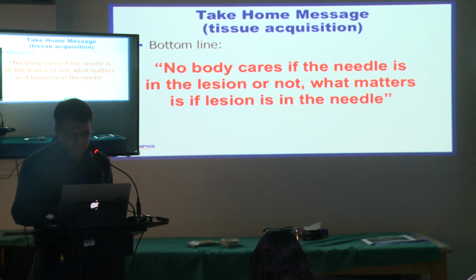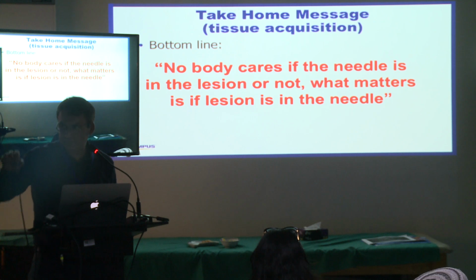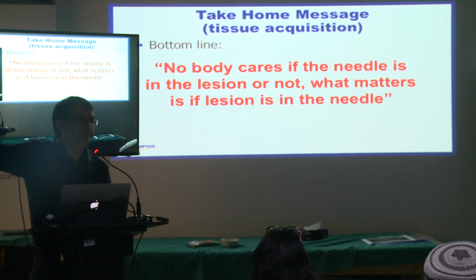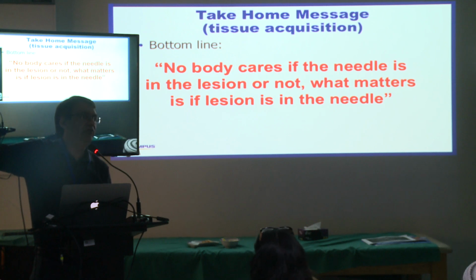The problem is technical, with the tissue acquisition, the use of the needle. I know most of the Indian colleagues in most of the Indian centers, whether they accept it or not, off the record at least they've confirmed to me that they reuse them. They are reused, even for tissue acquisition. Even for cancer ones? Even for tissue acquisition. Okay.